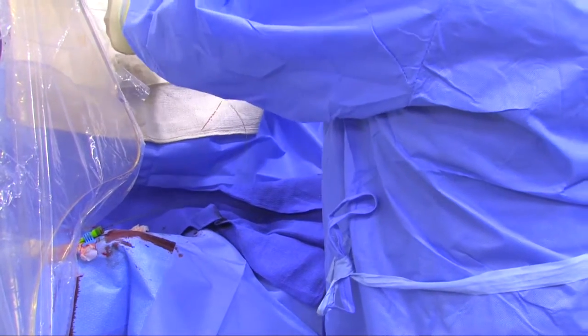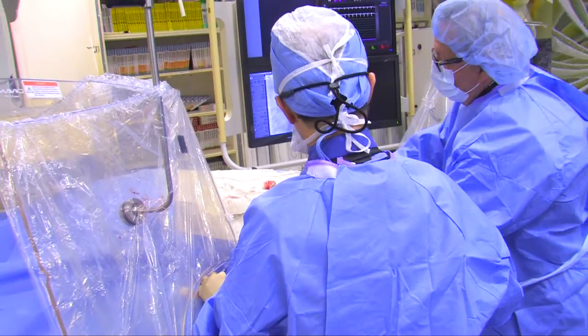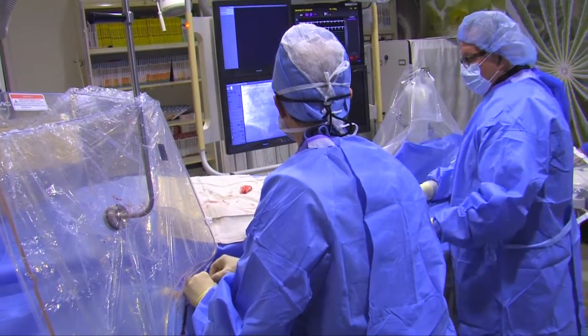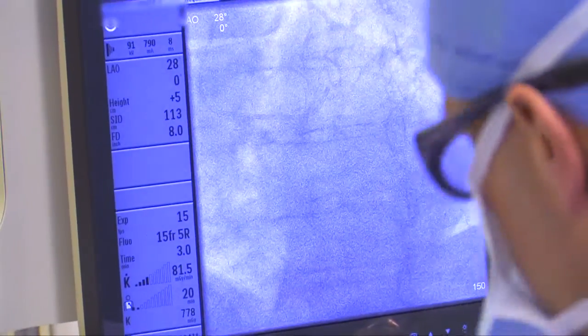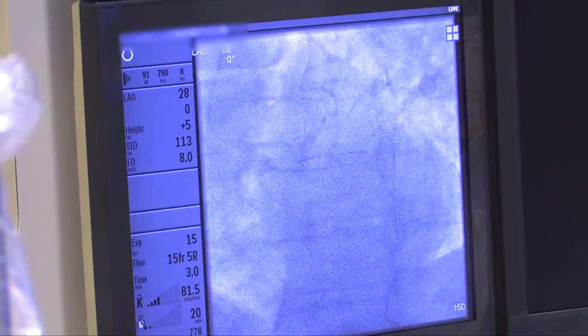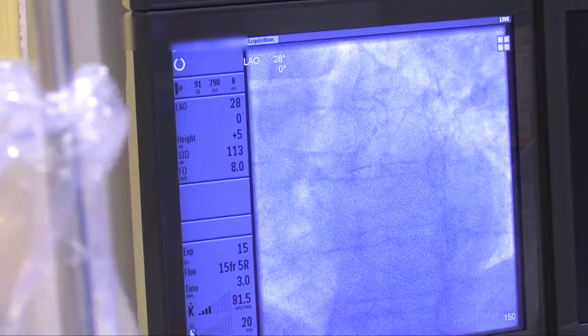Now we're going to put the new catheter in. We always wipe everything to make sure there's no blood or clot anywhere we don't want it. Steve is going to hold the wire pinned while I feed this new catheter — here it comes. We're hoping this one is going to fit a little nicer because it's got a bigger curve. He's a big guy with a large aorta, so the other catheter didn't quite fit. Steve is again going to flush meticulously, getting rid of all the air bubbles. This one fits perfect. Now we're going to shoot the left coronary artery — we just finished shooting the right.